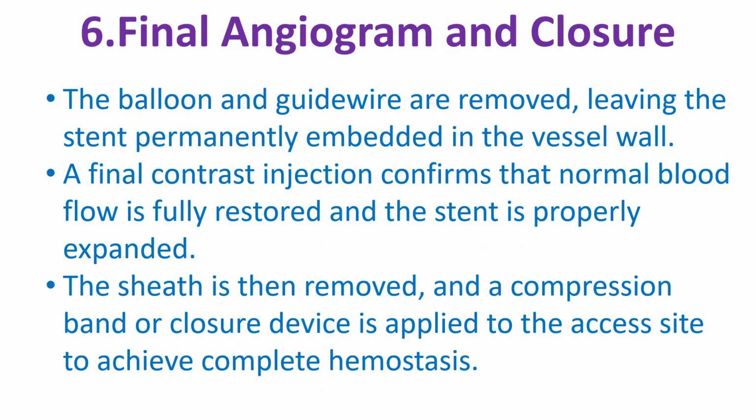Final angiogram and closure. The balloon and guide wire are removed, leaving the stent permanently embedded in the vessel wall. A final contrast injection confirms that normal blood flow is fully restored and the stent is properly expanded. The sheath is then removed and a compression band or closure device is applied to the access site to achieve complete hemostasis.